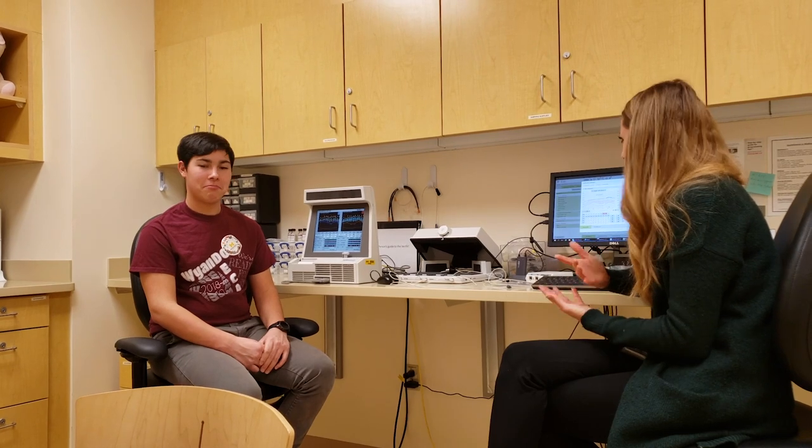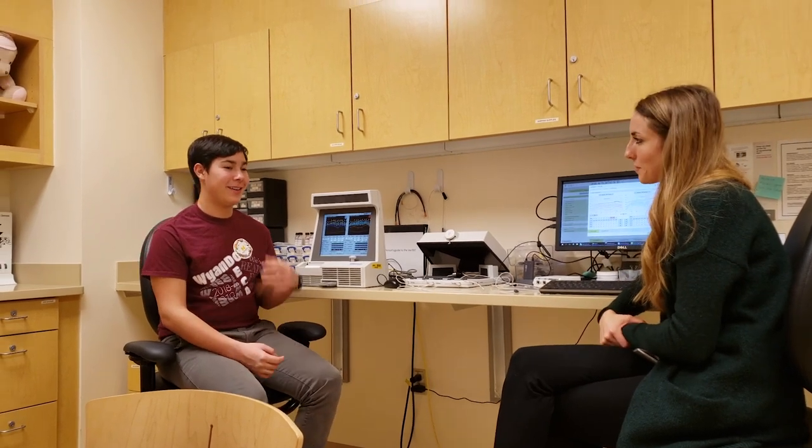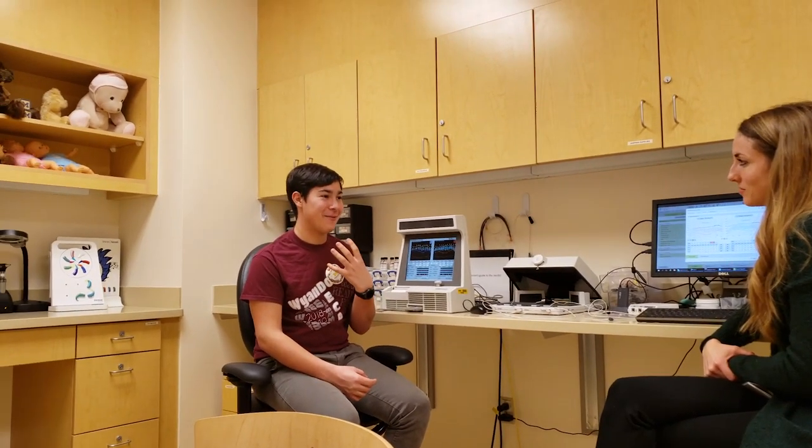As far as what's going on in the middle ear, I hope that's not affecting too much of today's fitting. No, I think it's good. It's really weird hearing my voice — it's very different. But your voice is very, very clear. Like it's a cut-through, right through.